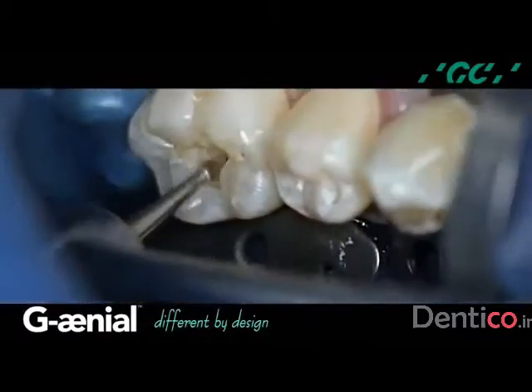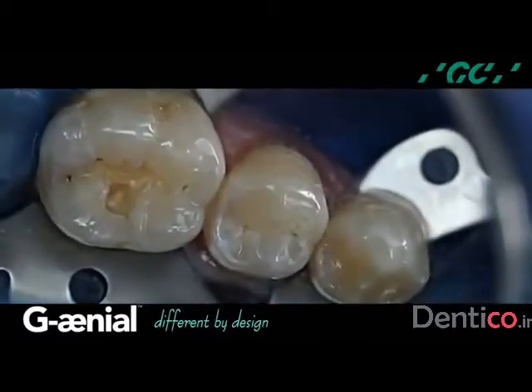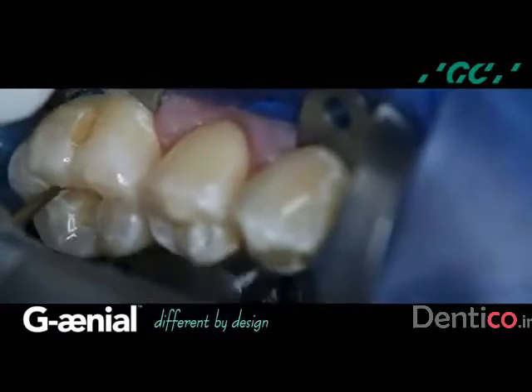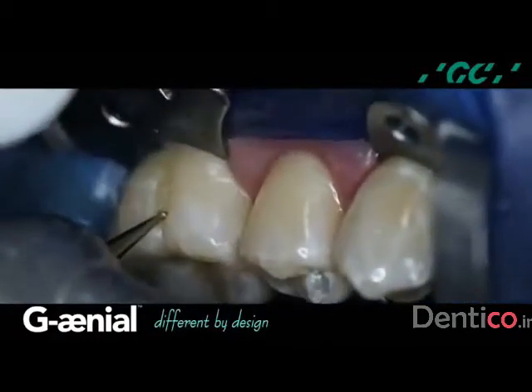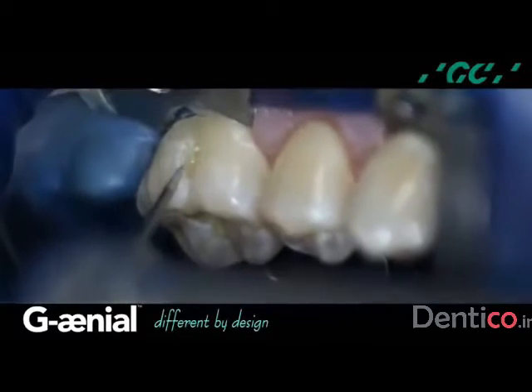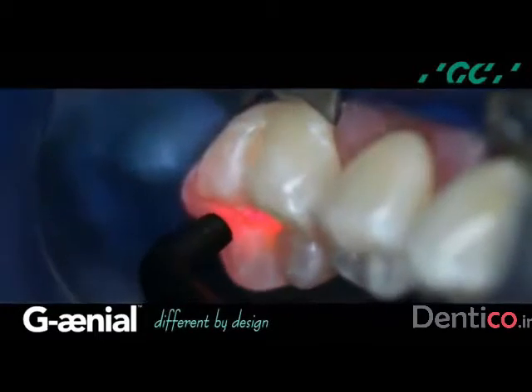The carious dentin is removed with the number 4 slow-speed carbide round bur by Brasseler and visually re-examined. This process is continued until all the destructive demineralized process is eliminated. The composite restoration is removed with a number 2 high-speed round bur using a water spray. A bevel is placed on the buccal preparation to integrate and disguise the composite restoration, but not on the occlusal. And a final caries reassessment.